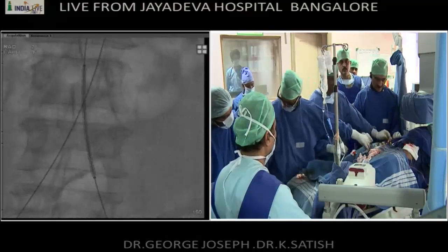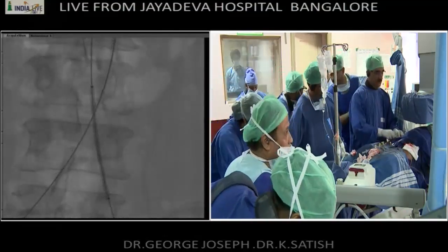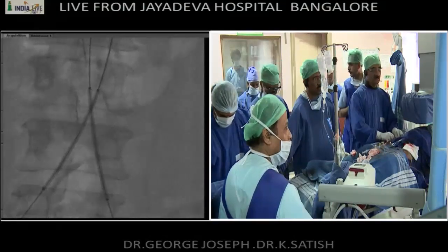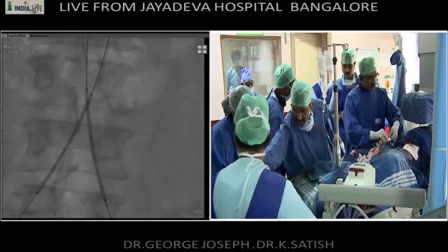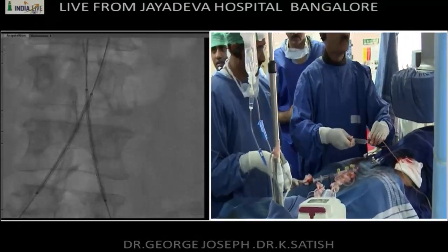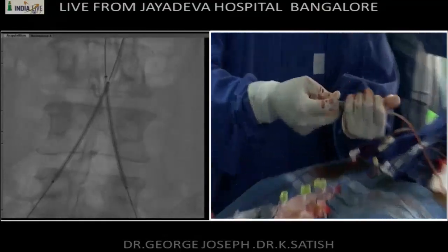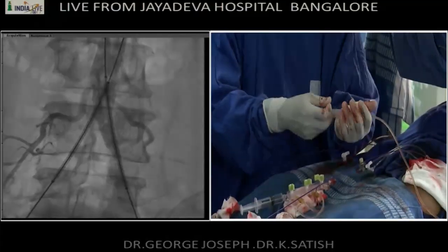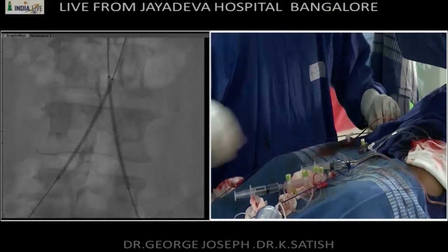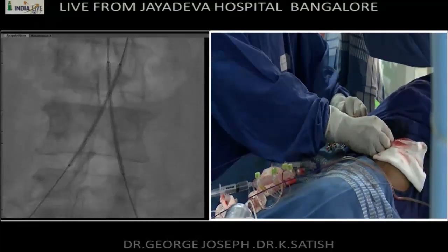I would think that I may have to extend a little bit on both sides, but let's see how it goes. Now I have a catheter from the brachial approach, so I'm going to test through that just to see if my position is good. Contrast? Yes, sir, contrast. Okay, center the stents. Yeah, that's good. All right, I think I can go in a little bit on both stents. I'll go till here. Okay, I think we can now deploy.